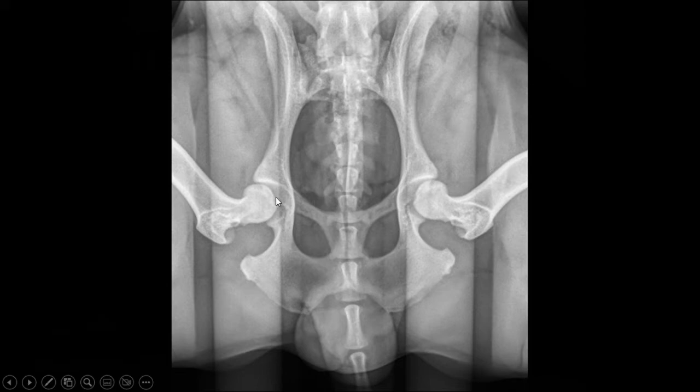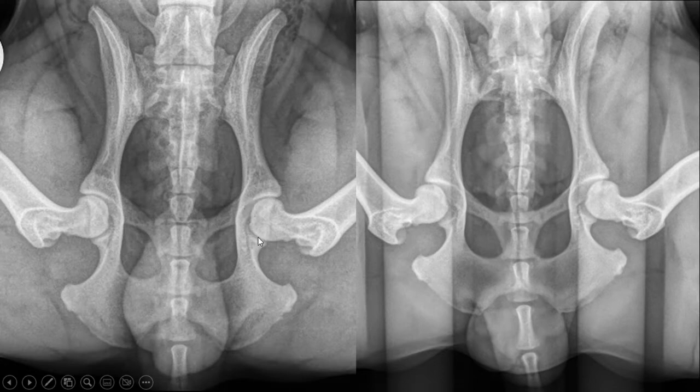And then you can see here that these hips are feeling the distractor. It's not painful by any stretch, and it does not drastically move these hips out of the socket or anything like that, but you can see that there's a little bit of movement with that mild pressure, moving the head of the femur out of that socket a little bit. As a comparison, you can see the before on the left where those femurs are really in those sockets, as opposed to that mild pressure moving the head of that femur out a little bit.